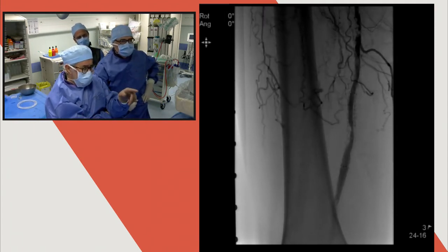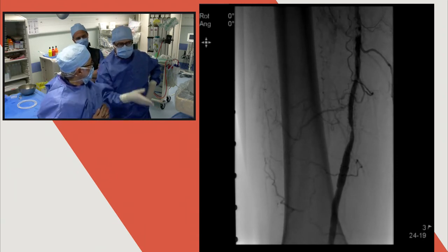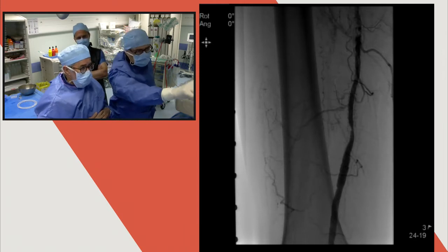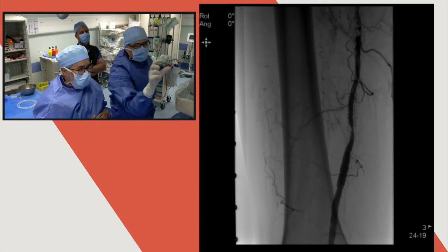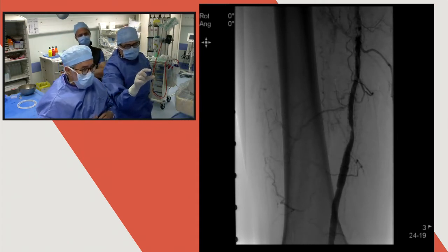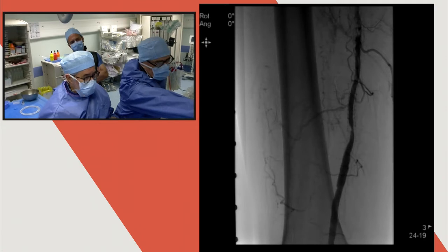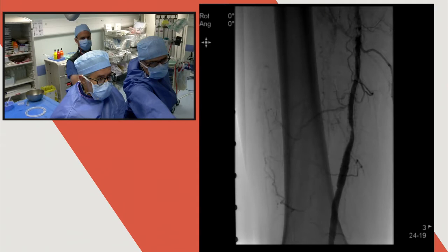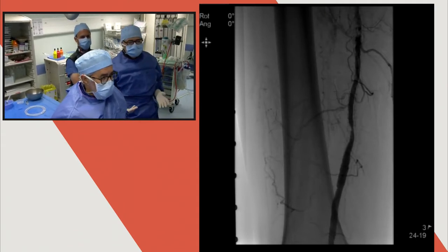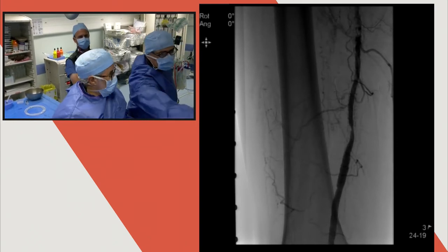Would you consider doing a drug-eluting balloon in the second lesion? In my practice, I would treat the entire SFA with DEB. We can discuss whether we should limit dilatation here focally to the in-stent restenosis in the middle of the stent. And then we can also start treatment at the level of the distal end of the balloon expandable stent, upstream to the side branch of the SFA. So that would be my strategy. I wouldn't touch the segment in between. This is okay. I agree. I will not touch it.